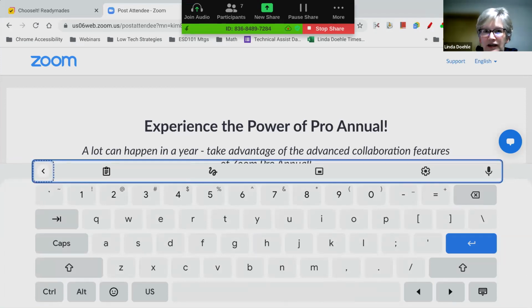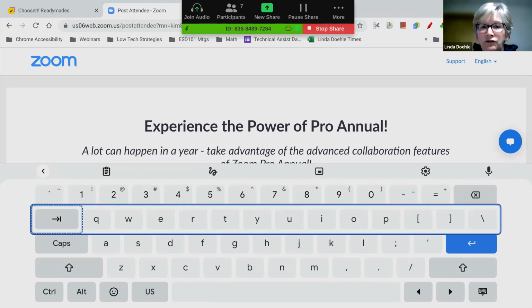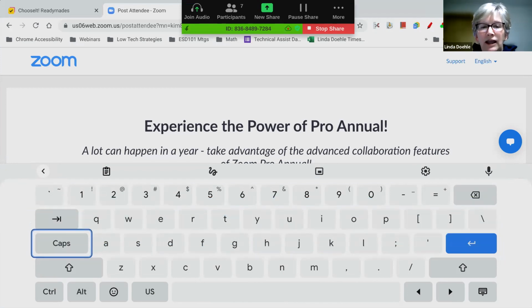Do you see how it scans correctly? It looks like it's going to work beautifully. And so then I'm going to choose a line, and then it will scan across. And then I can choose one of the letters. What I found is it's working beautifully, but it doesn't work within the apps.